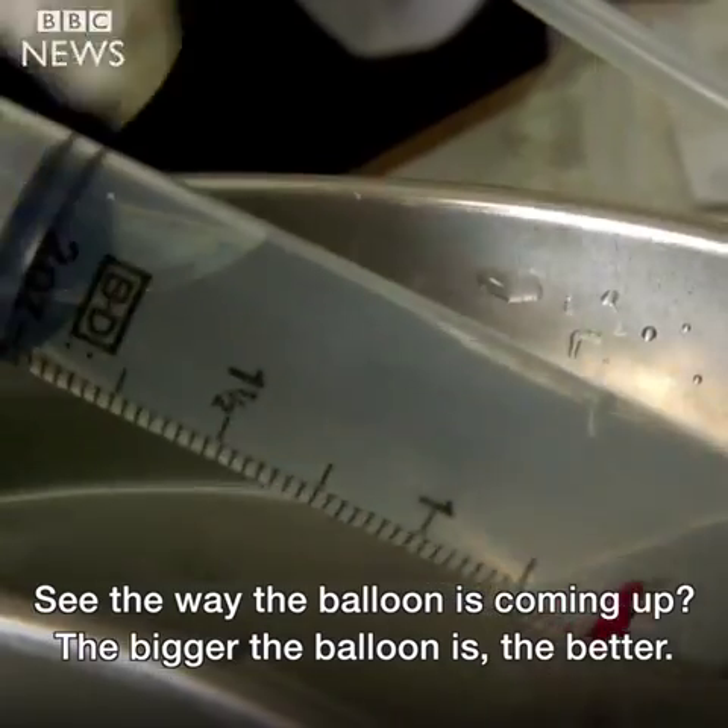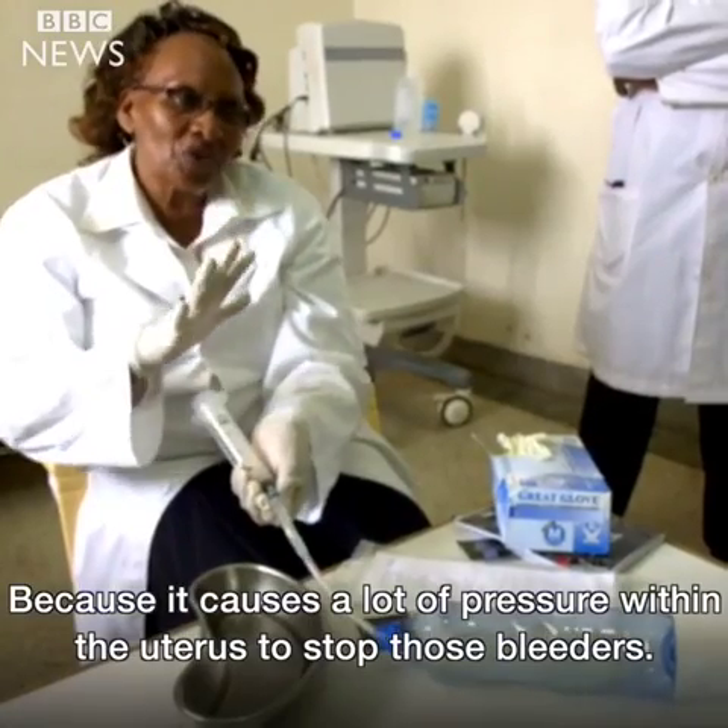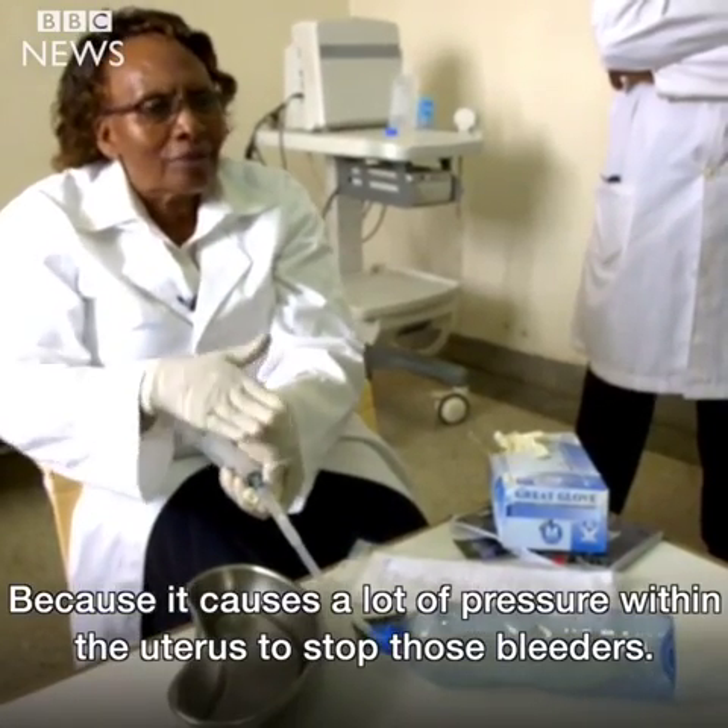The bigger the balloon, the better, because it causes a lot of pressure within the uterus to stop those bleeders.